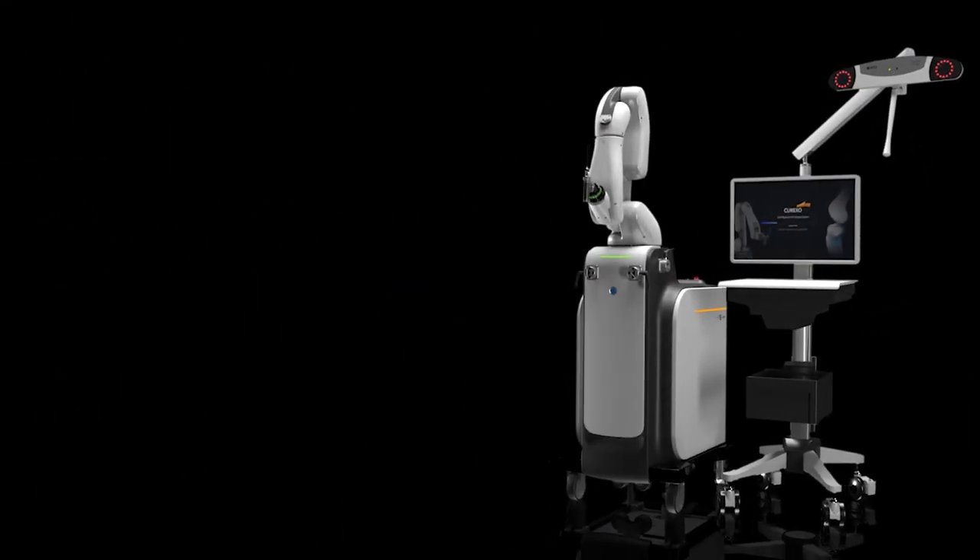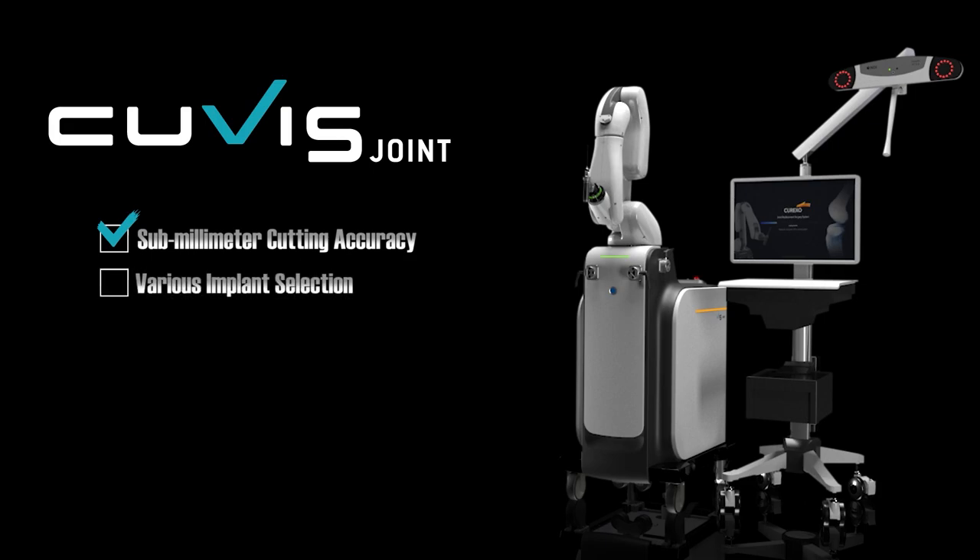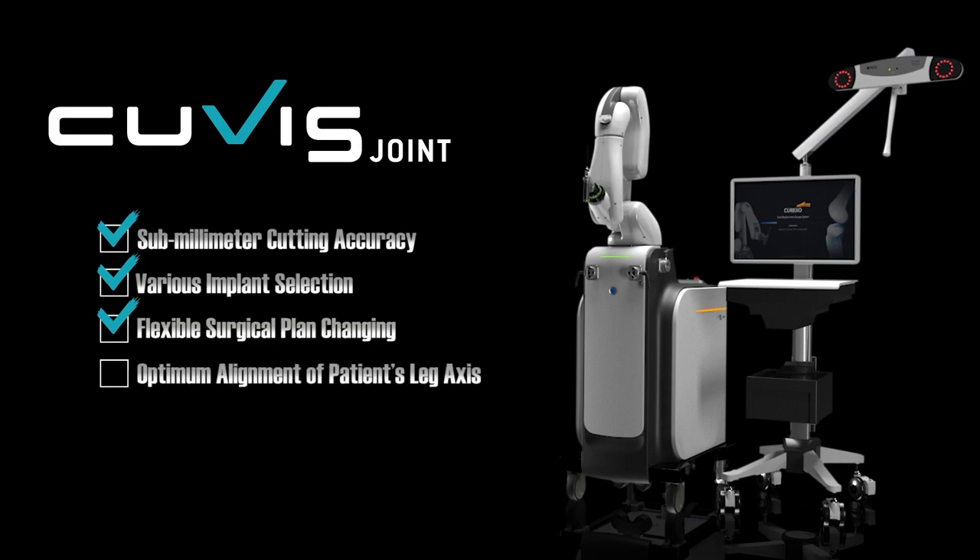CUVIS Joint: a safer and more accurate TKA surgery with sub-millimeter cutting accuracy, offering various implant selection, flexible surgical planning, optimal alignment for the patient's leg, and fast recovery of patients.